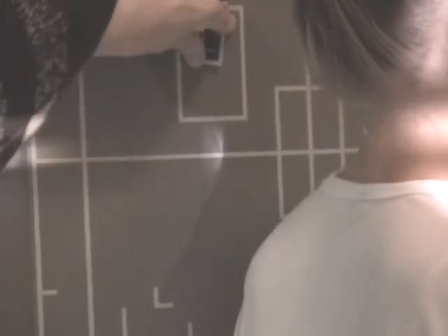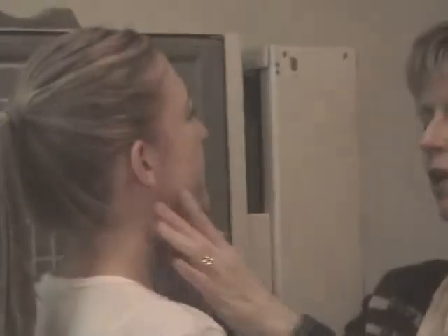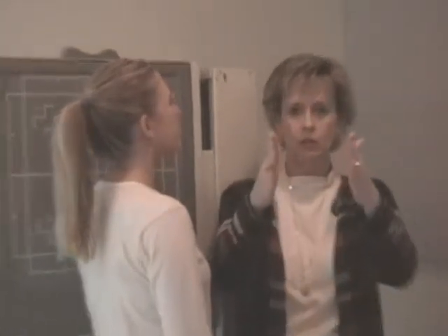Leave your length, but the neck will dictate side to side how much collimation you have. And then once you determine your collimation, you can put your L marker on the board. And the last thing you do is you come to the front of your patient and you make sure they're looking straight out at you, so they're not rotated. Again, you want them looking straight out at you. You don't want the head tilted and you don't want the head turned.